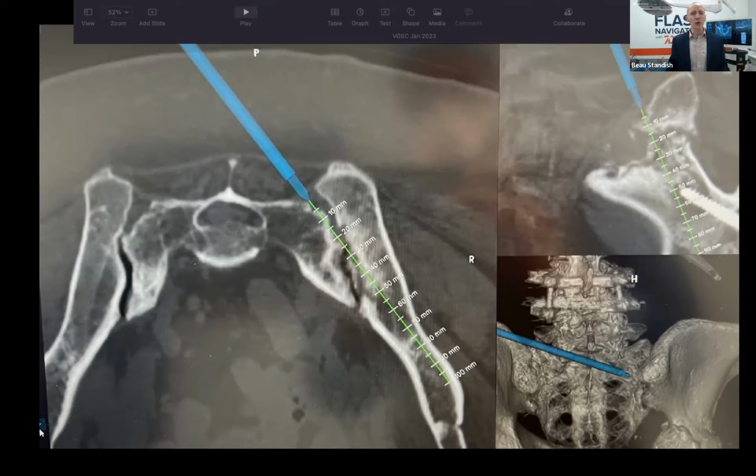Yep, we use those as existing fiducials to register off of. So we really don't suffer from that starburst effect of implanted metal. And in the latest software, you can switch between the registration off of the metal and the anatomy and flip back and forth in that visualization mode. That's a really nice feature. I've used that a lot.